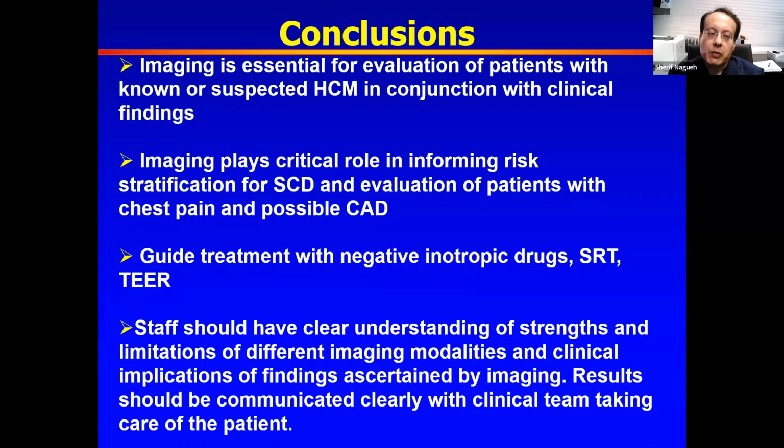I would also mention that the most important part is the staff should have a clear understanding of the strengths and limitations of the different imaging modalities and the clinical implications of the findings ascertained by imaging. The results should be communicated clearly to the physicians and the healthcare team taking care of this patient.